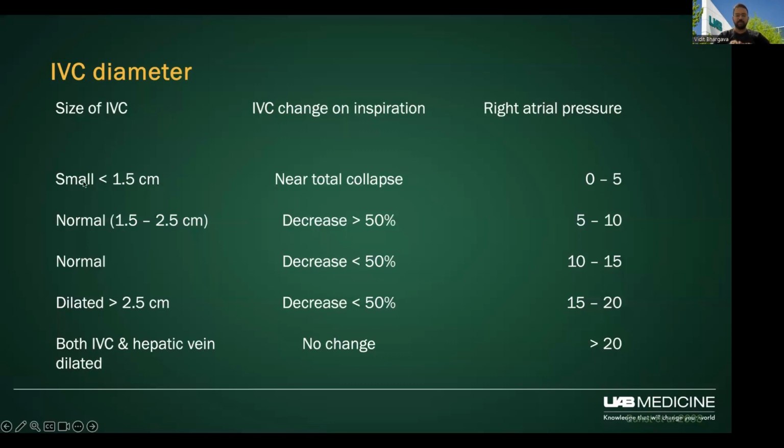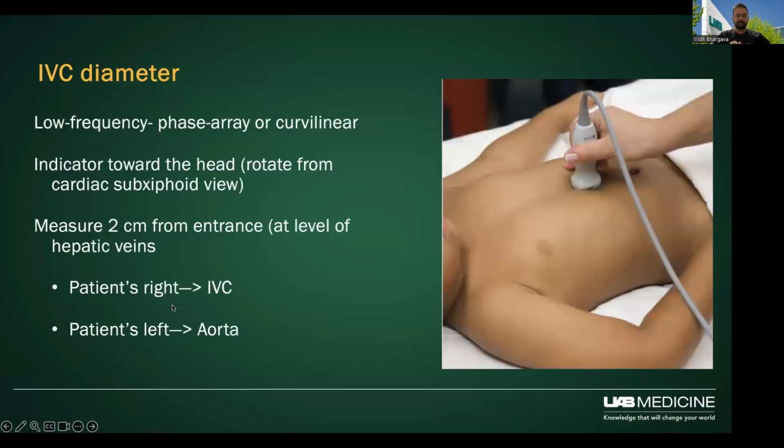And so really it's hard to use this data and extrapolate it into pediatrics. Nonetheless, the way I think about using just the IVC diameter is that it is almost not useful for volume responsiveness, but it may give me an idea about the patient's volume status.